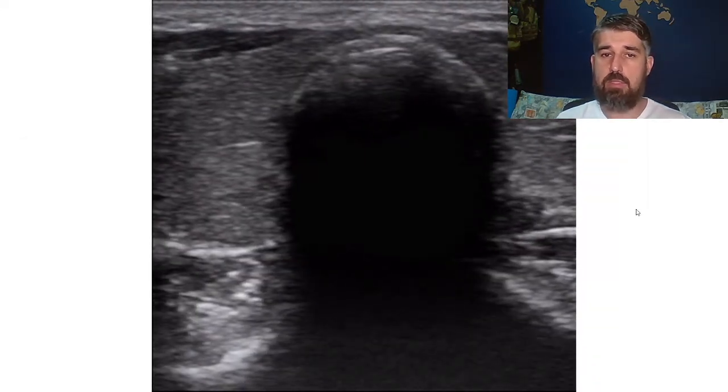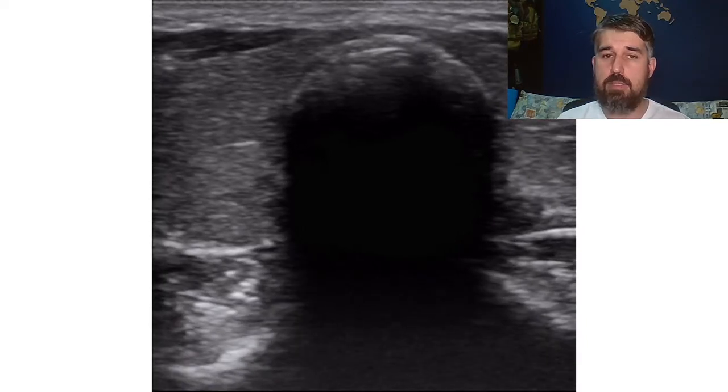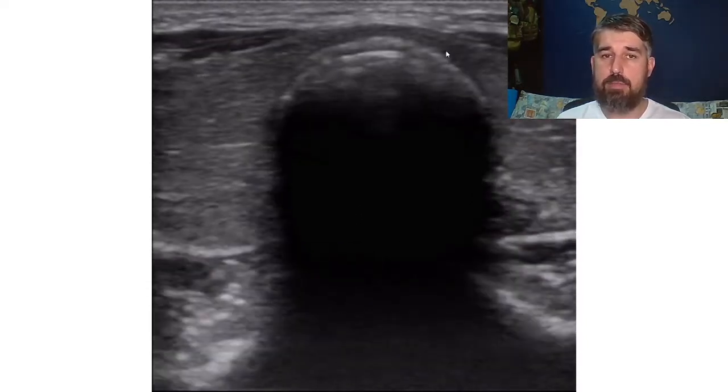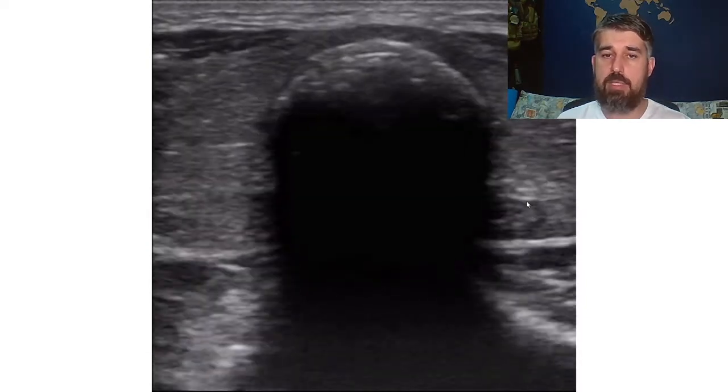This is a little video, but the same thing. We see just one image. Here we have the trachea and a shadow behind it.